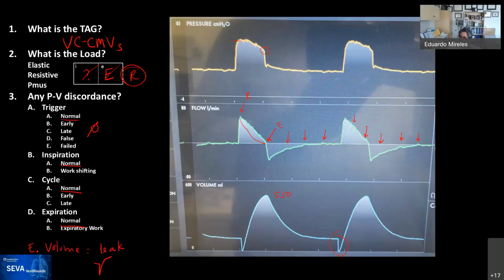I'd want to make sure that I have enough ventilation to guarantee good gas exchange while minimizing the amount of flow that goes through the leak. And therefore, if I could do that with pressure control, and I can assure that he is ventilating okay with pressure control, I think that'd probably be the best way to minimize the amount of flow that goes through the BPF.